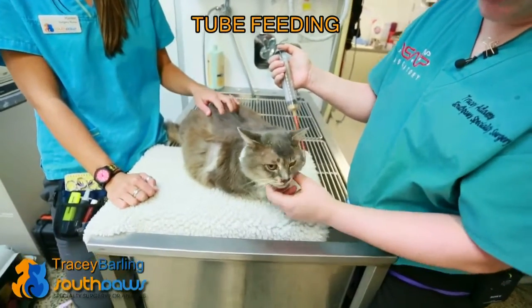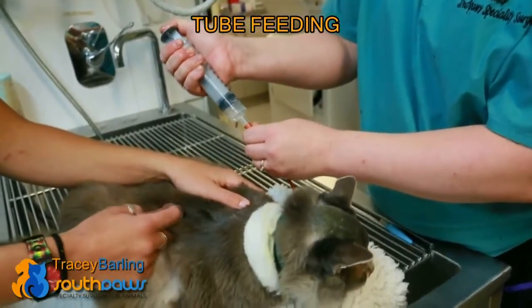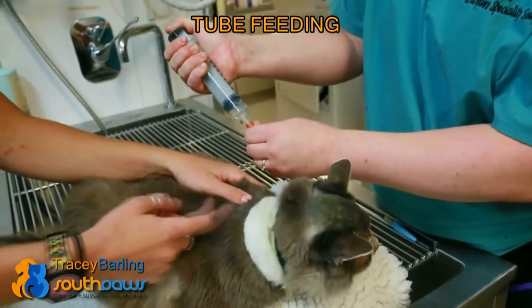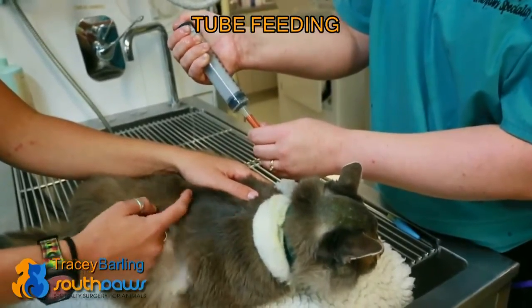It allows us to make sure that he is eating. If he does stop eating, the tube is already in and we don't have to anaesthetise him to place another one. We flush it with about ten mils of water just to ensure there's no food sitting in the tube so that it won't get clogged.